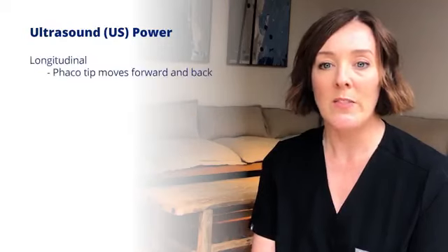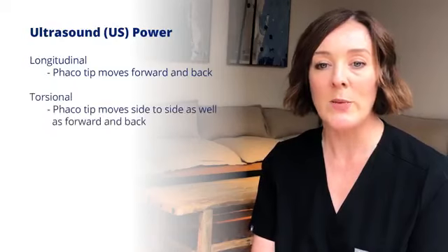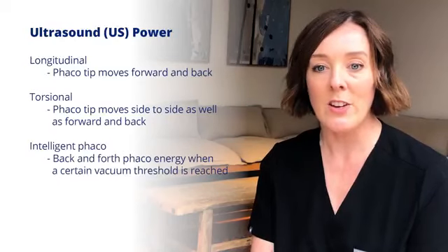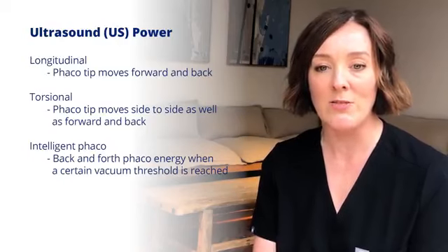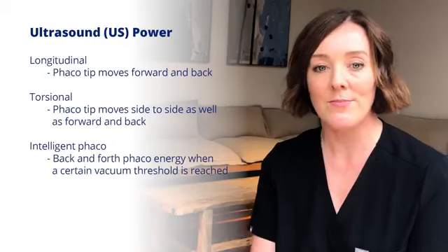Longitudinal phaco is where the phaco tip moves forward and backwards. Torsional phaco is where the phaco tip moves side to side in addition to forward and back. Intelligent phaco allows a measure of back and forth phaco energy when a certain vacuum threshold is reached. This helps to clear clogs without the surgeon needing to do anything.